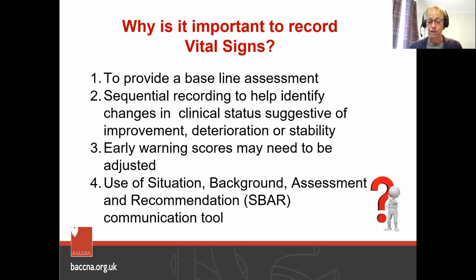It's also important that a senior member of the medical team or clinical team who understands what's normal for each patient is the person who is responsible for changing parameters within an early warning score. It's important to avoid repeated and inappropriate triggers that are at best an inconvenience for the patient and staff. But at worst, we need to make sure that we don't cause inappropriate treatment to be delivered to a patient based on the early warning score alone. So it's important to recognise when the complexity of clinical decisions requires specialist knowledge and expertise, and that you know how and who to refer to.